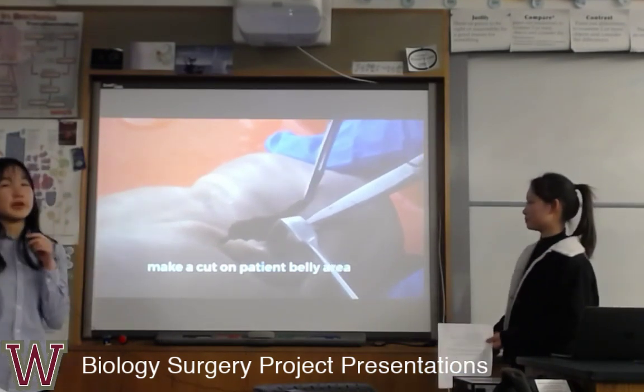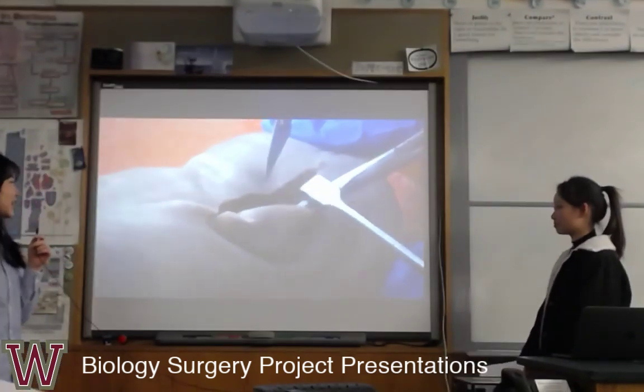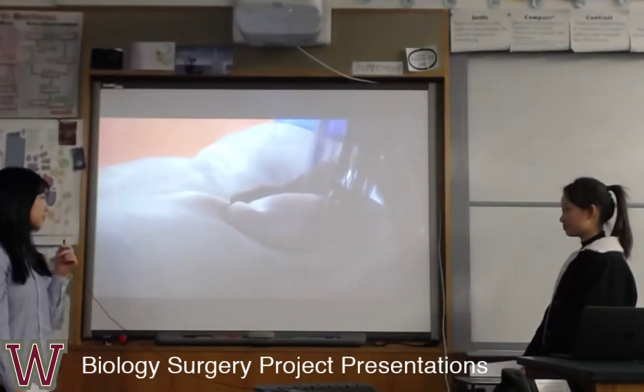And we will cut it very carefully in case we cut the kidney and other organs.